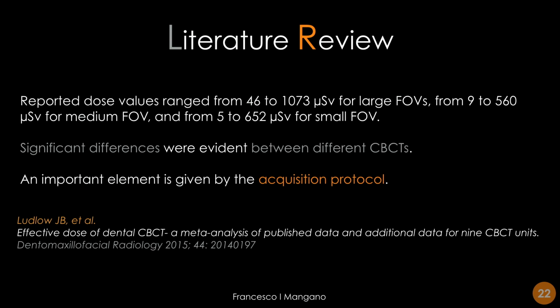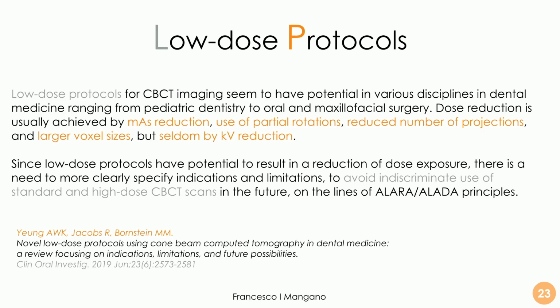We can find CBCT in almost all dental offices, and so it's very important to apply the proper protocol in order to reduce the dose to the patient and to follow the recommendations given by the different institutions in terms of reduction of the absorbed doses.